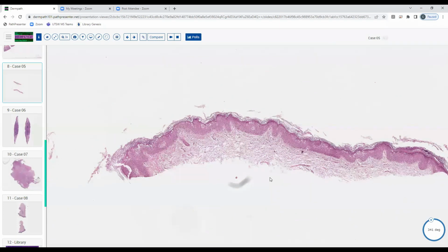I couldn't really decide. It's kind of interesting in this condition that we'll talk about in a minute. Is this condition always seen in inflammatory disorders? Is this pattern we're looking at? Hmm. I'm going to think the answer is no. It's hard to ask questions that aren't leading questions. I know. Totally open-ended, but yeah, you're right. The answer is no. We'll talk about that in a moment. But this very well could be an inflammatory process also.